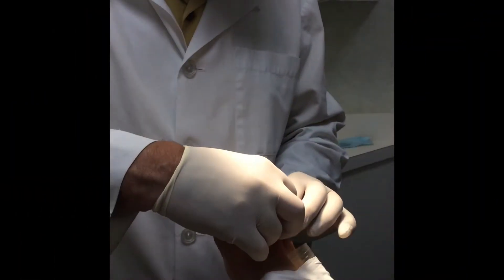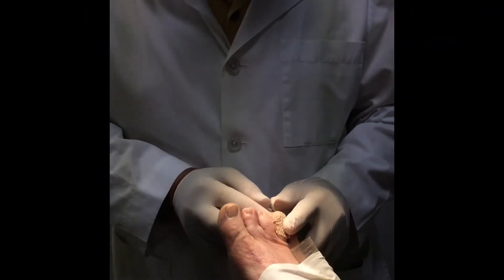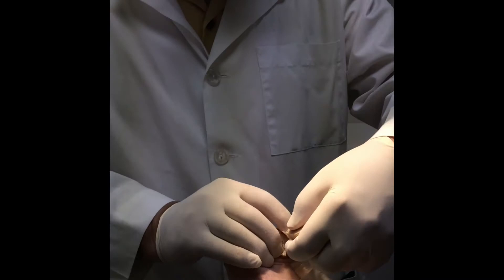Hi, it's Dr. Paul Potash. Today we are going to remove a patient's toenail using a laser.